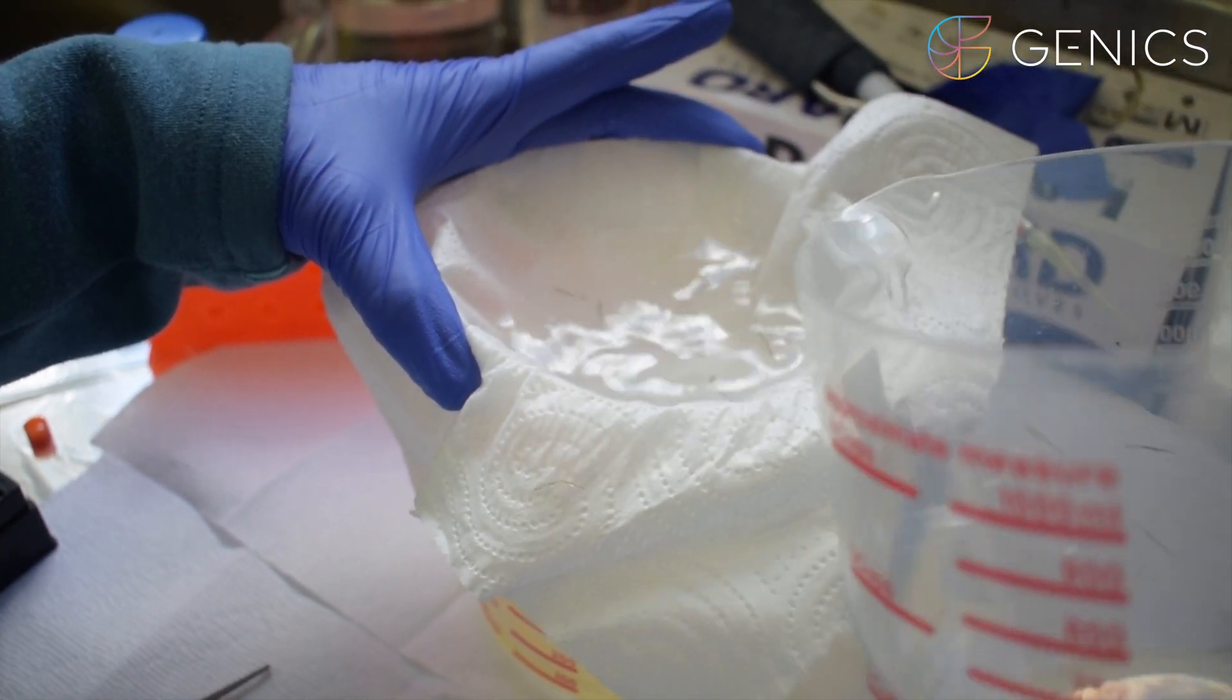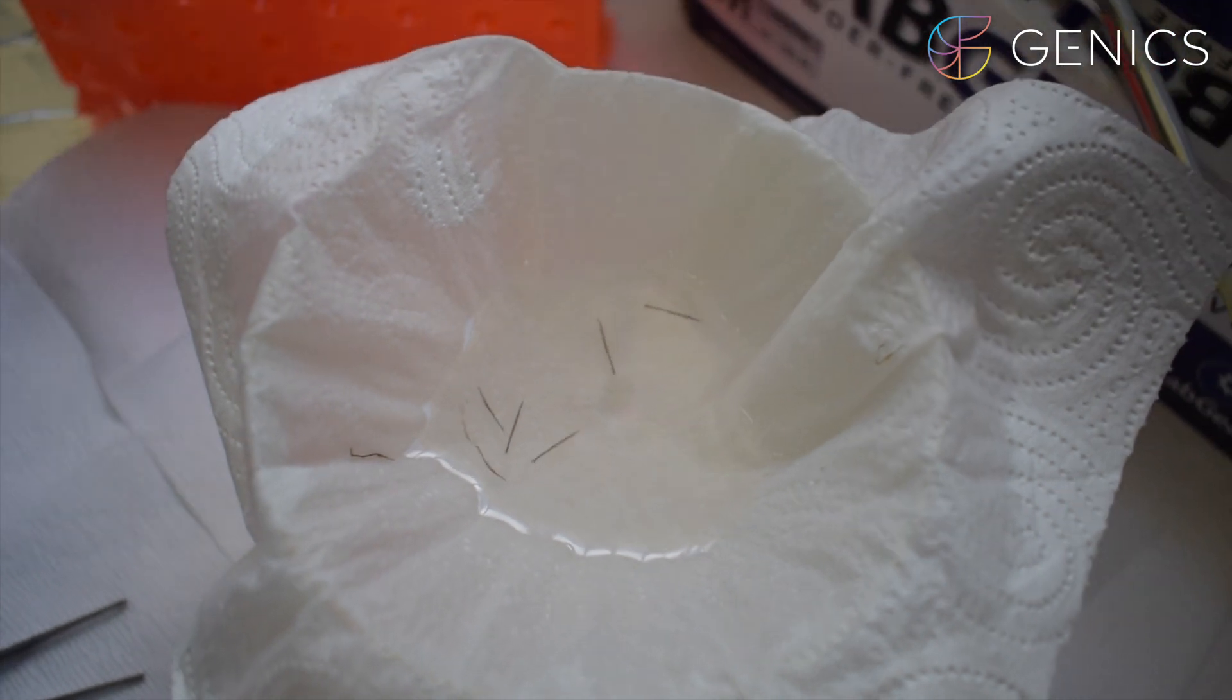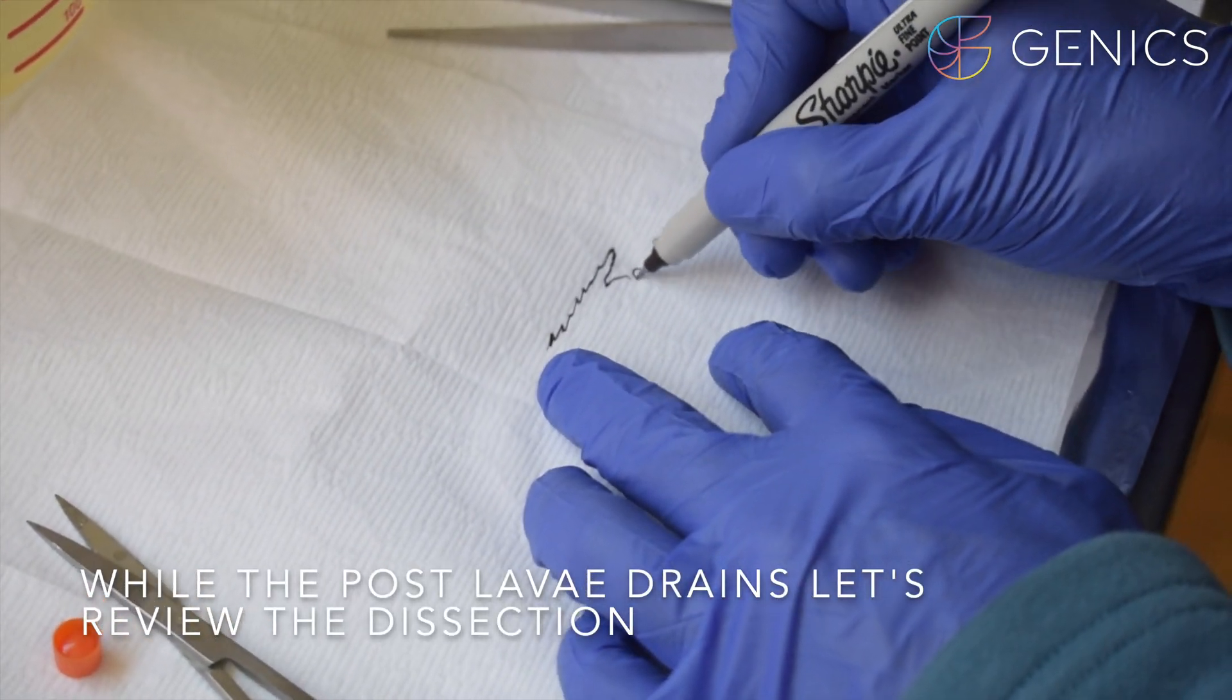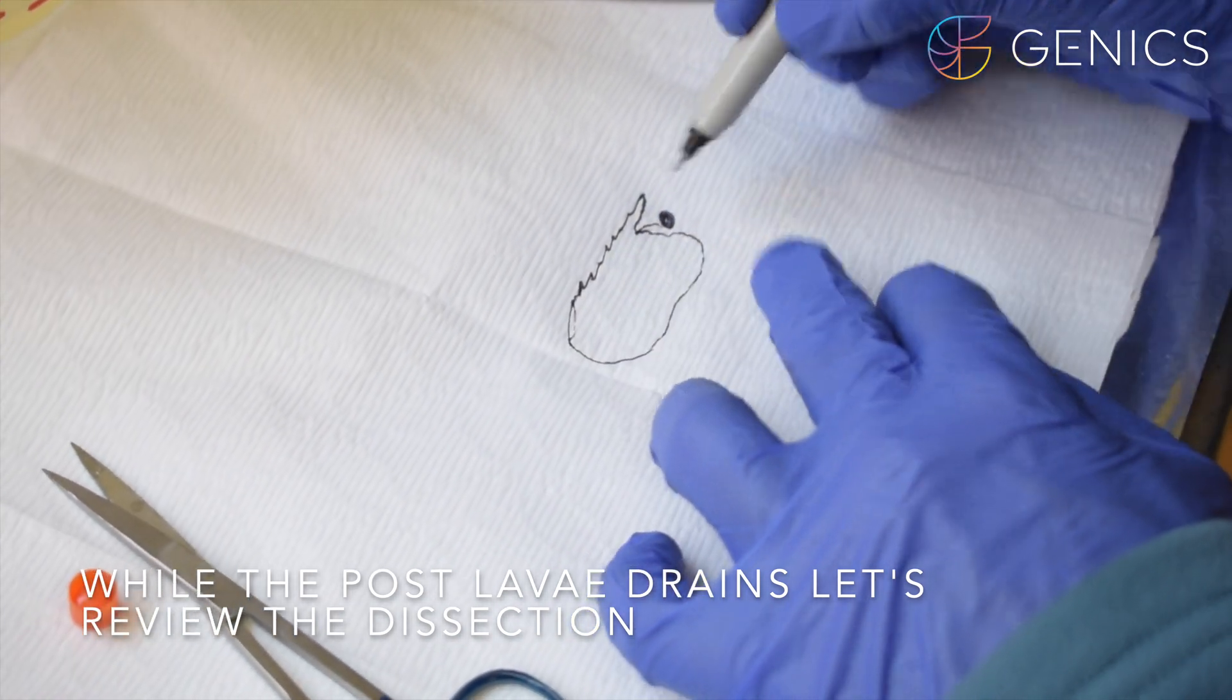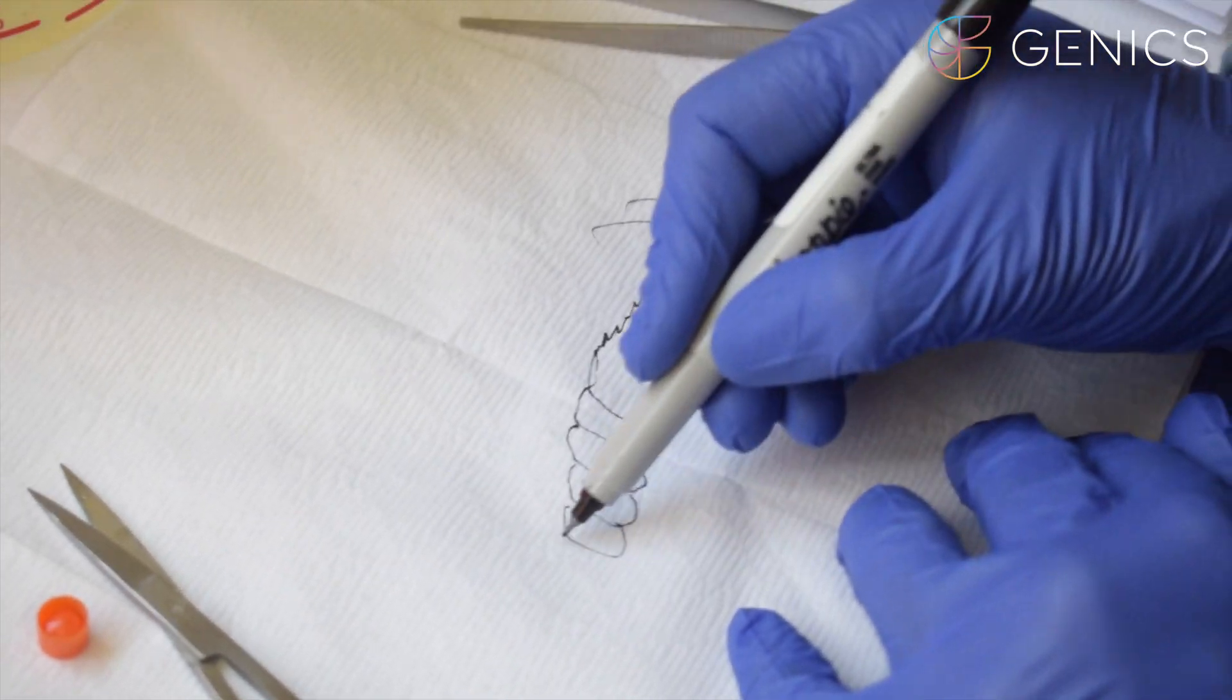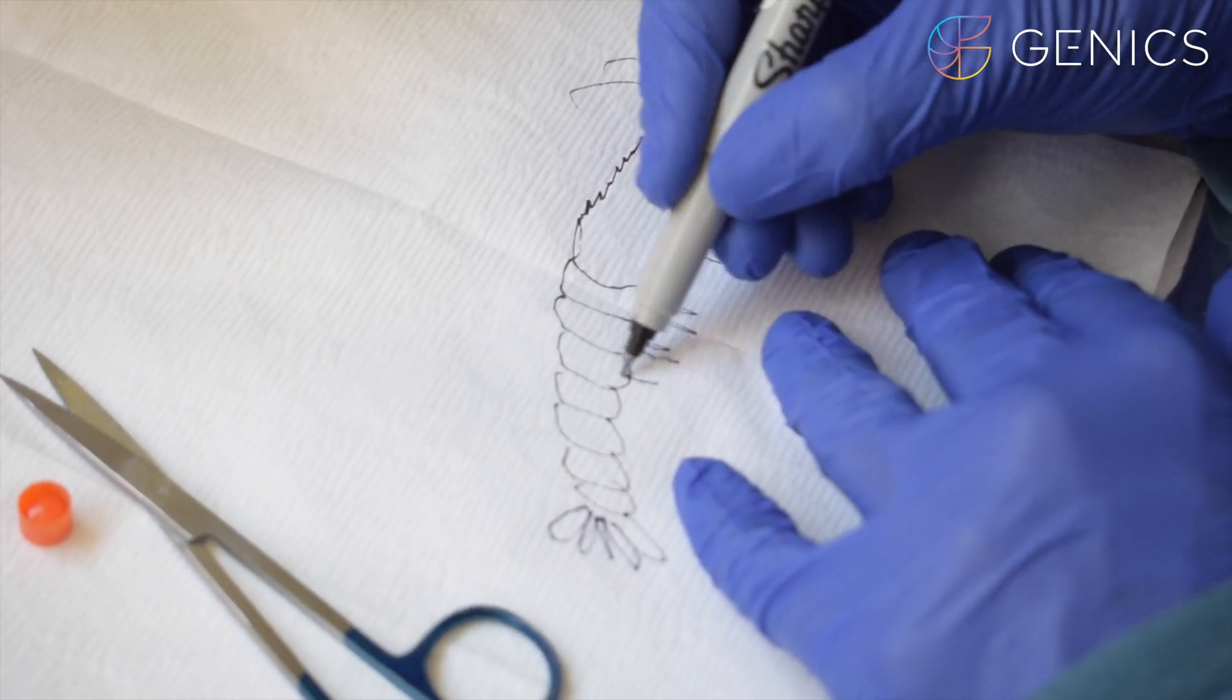Whilst we wait I will draw you an image of what we are about to sample. Here we have our post larval shrimp head, our eye, shrimp antennae, periopods, shrimp tail muscle and pleopods.